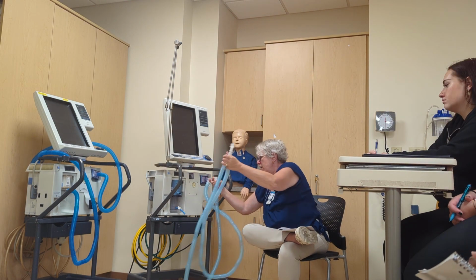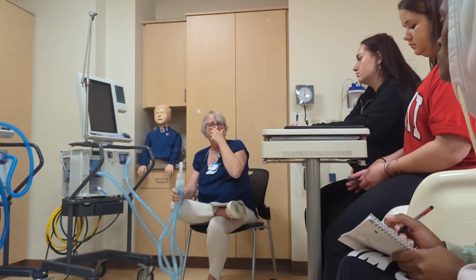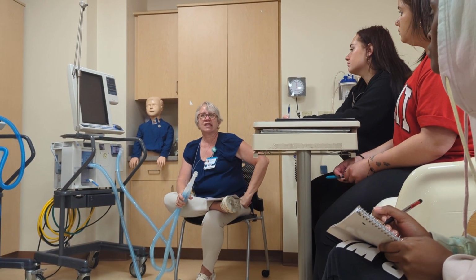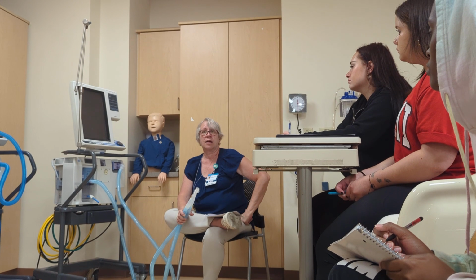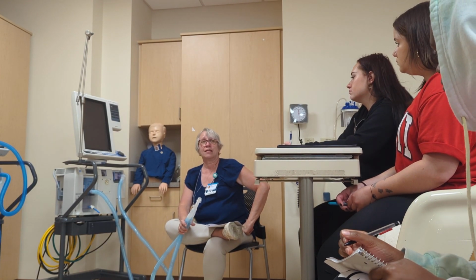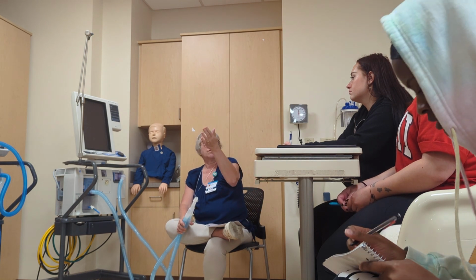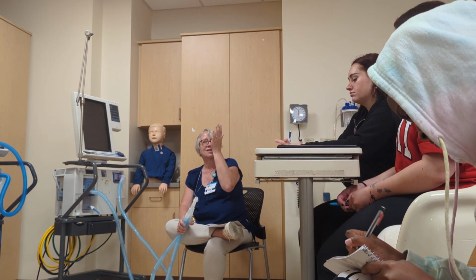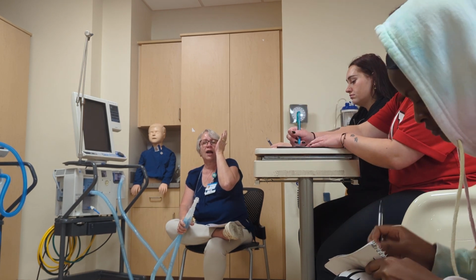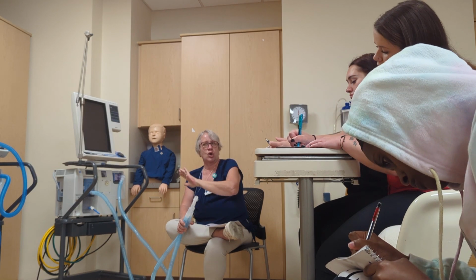When we are doing mechanical ventilation, if you're not getting pressure and you're losing volume, and I'll say this 100 gazillion times, you have a leak, okay? Low pressure, low volume equals leak. You need to figure out how to see if it's your patient leaking or your circuit.